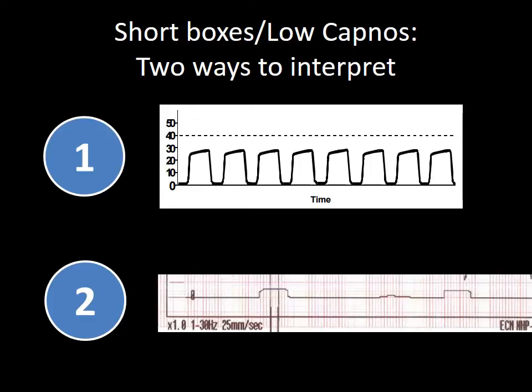There's another way to interpret that. We could be hyperventilating, but in scenario two, the patient is breathing so tight. She was so full of fluid that we didn't get any carbon dioxide return. So you can see how low this is. The patient was breathing 44 times a minute. However, we weren't getting any capnography. We weren't getting any gas back to our machine. So she was so tight.